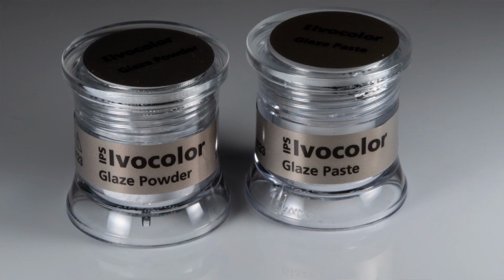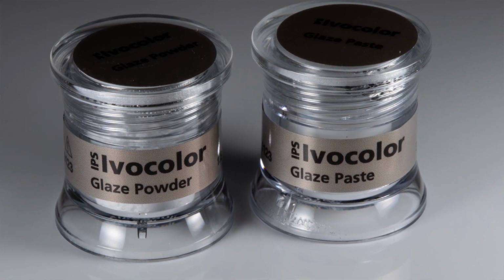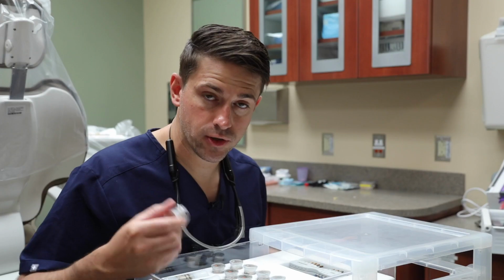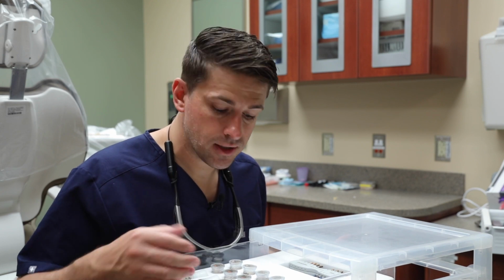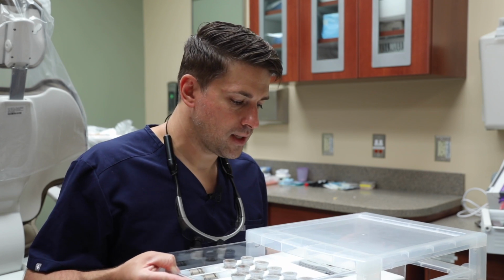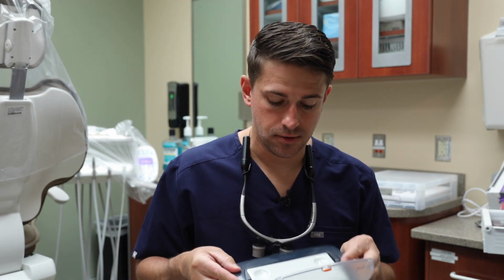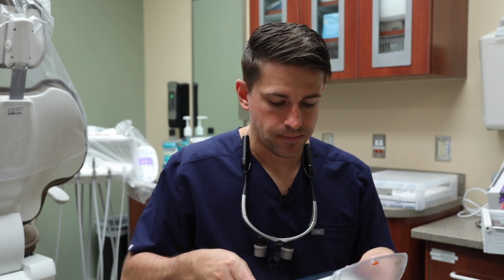There's a glaze powder, which you can mix with the mixing liquid to make the glaze, or it comes with a glaze paste, which is kind of already pre-mixed, so to speak, that you can put on. For the last few I've done, I've actually used the glaze paste, and it worked really well. And so that's what I'm using for the next step. So I take some of the glaze paste out and I put it onto this tablet here. This is designed to hold all of your stains and glazes and mixing liquid.